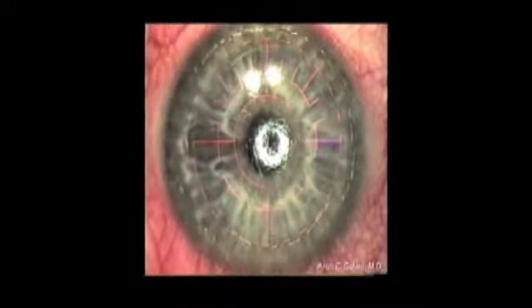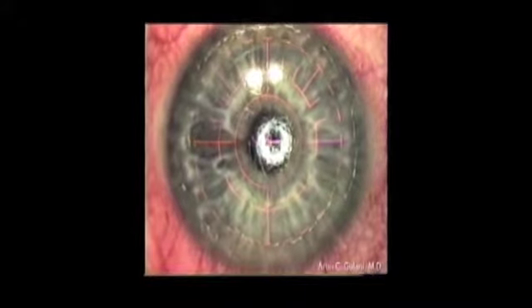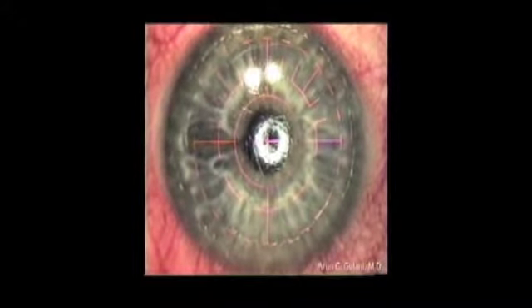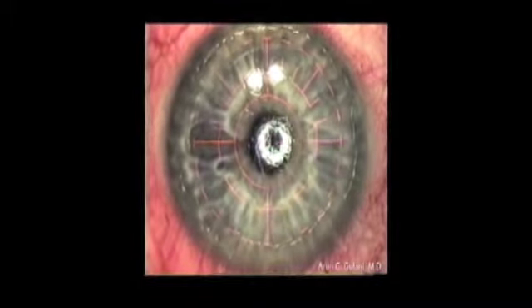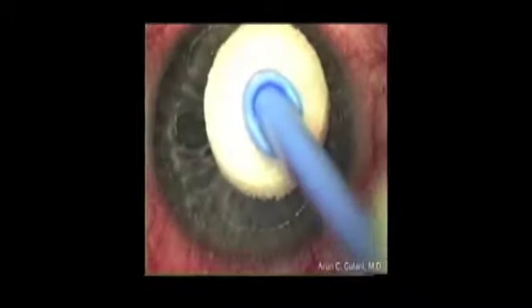Therefore, in summary, in-corneal scars can be lasered directly in the PRK mode, as you can see here, shaping the cornea, and indirectly removing the scar straight to a visual outcome.